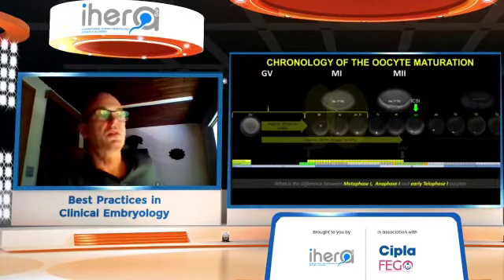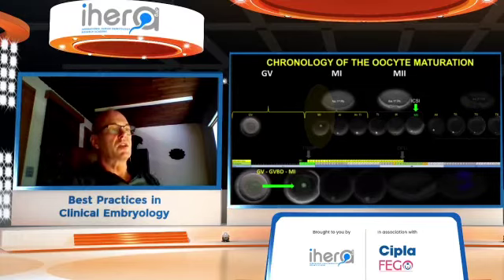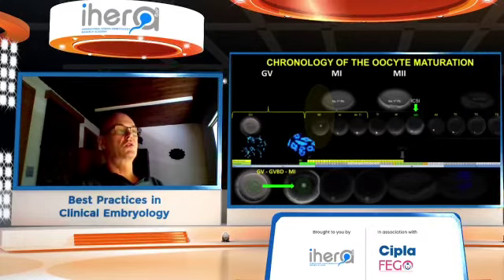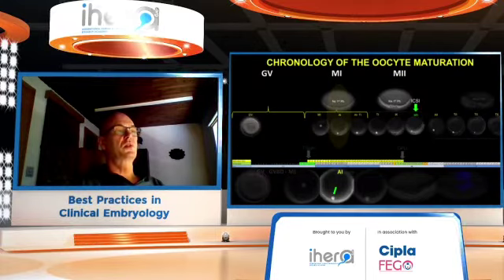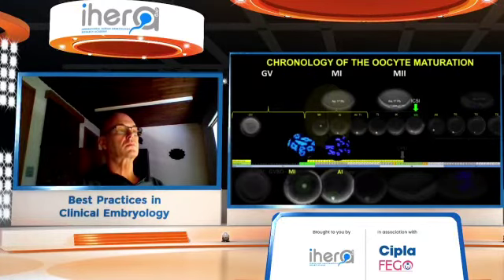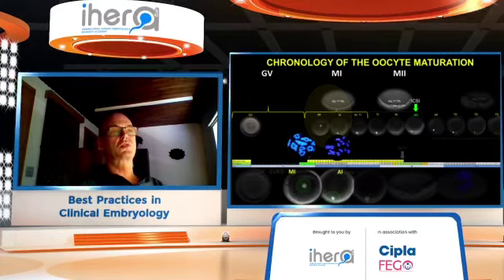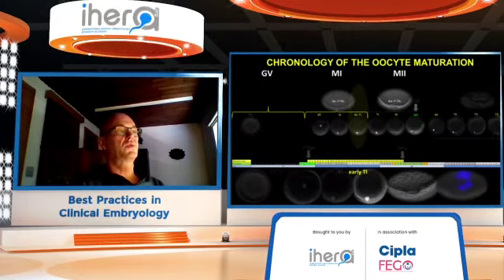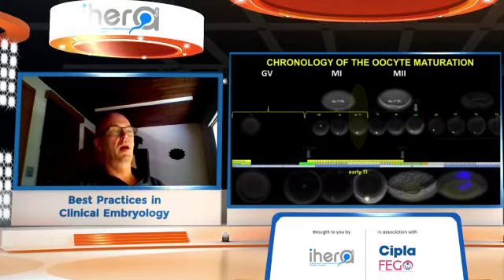Now we should explain the difference between metaphase, anaphase, and early telophase oocytes. In M1 oocytes, the spindle is localized centrally, corresponding to the previous position of the GV, and the chromosomes are still in the form of homolog pairs. During anaphase, the spindle moves to the periphery of the oocyte and the chromosomes are already segregated. The position of the spindle and segregation of chromosomes is a crucial difference between metaphase and anaphase oocytes. In early telophase, we can find the first signs of cytokinesis as very subtle protrusions of the oolemma.